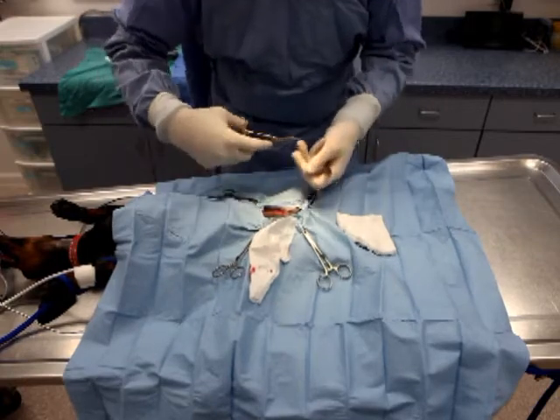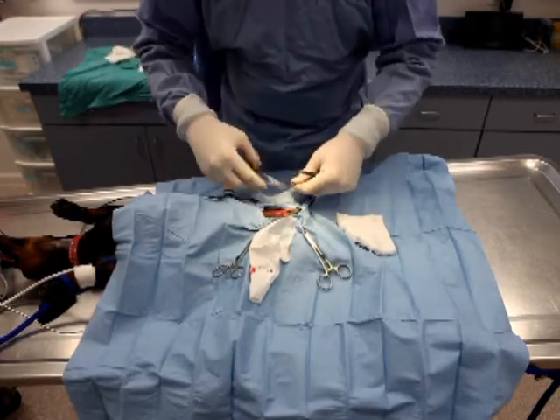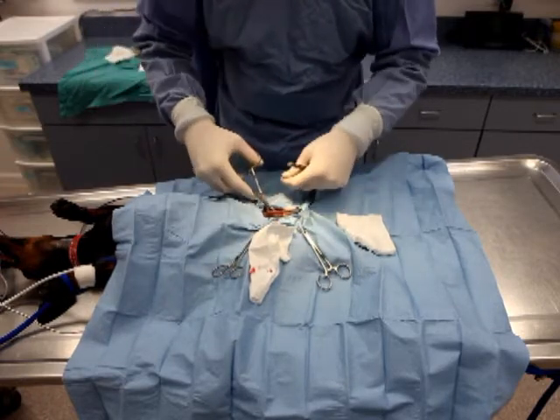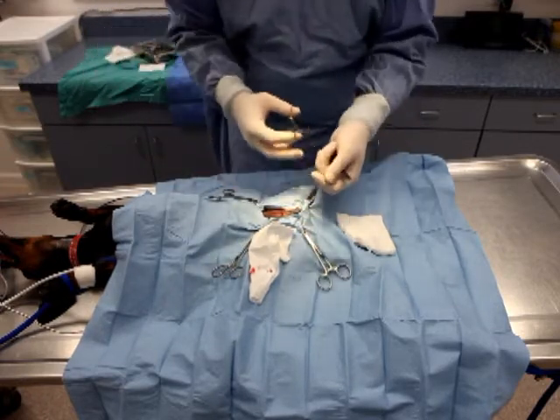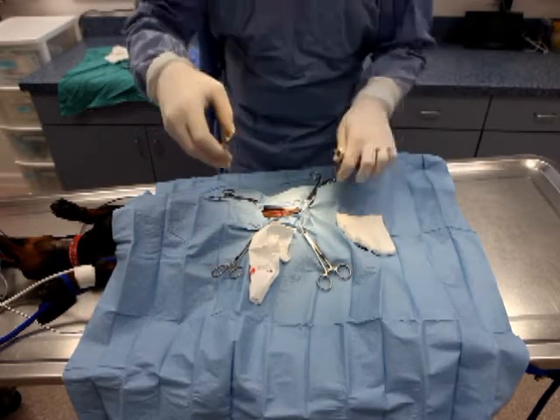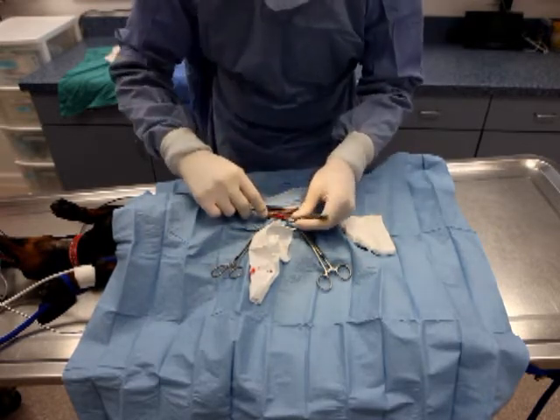At our practice, as mentioned before, we started using 2-0 PDS on a reel, which has not caused us any issues and has actually saved us about 90% on suture materials for each procedure, with the cost going from $8 down to $0.60.